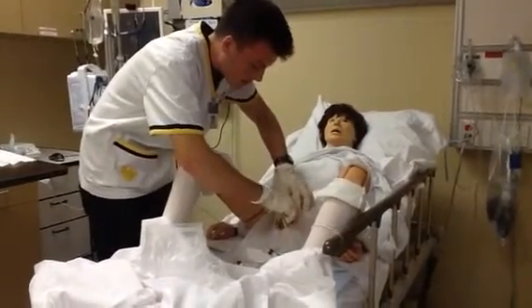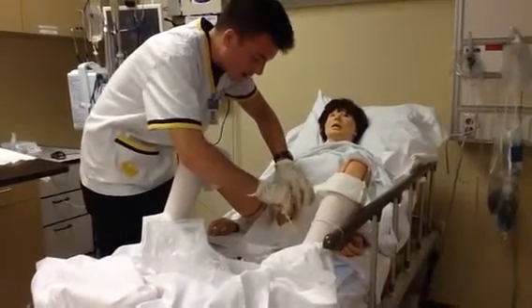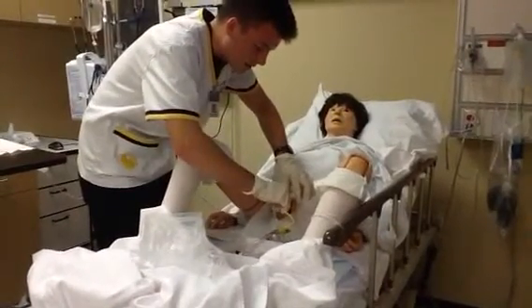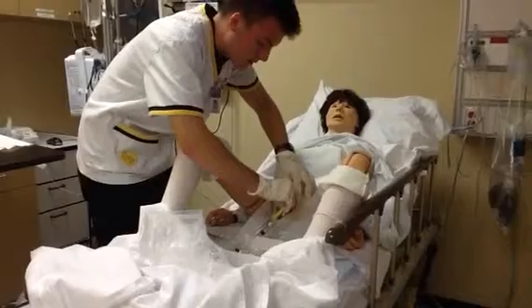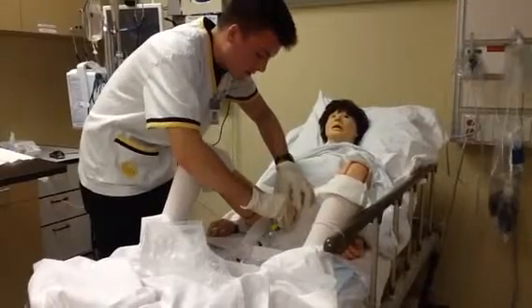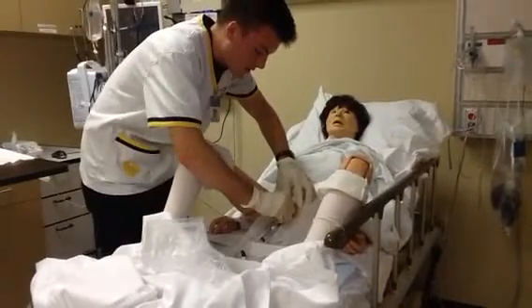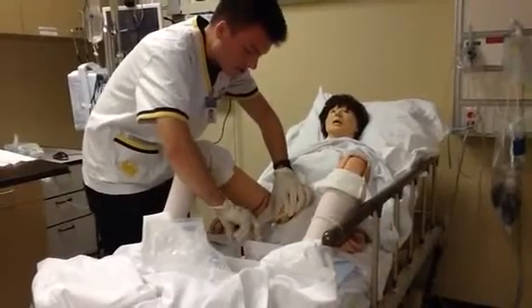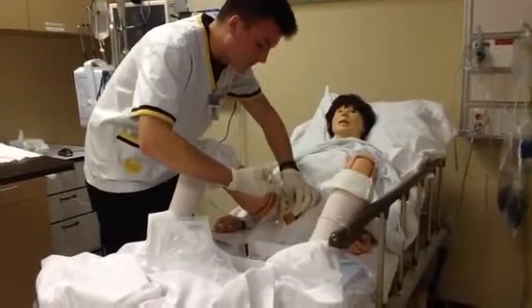And I will begin catheter insertion, making sure that the catheter does not touch any skin on the way in to keep it sterile. Making sure that my right hand does not touch any skin to keep it sterile. Continue to insert it. Okay, I see urine, so I'm going to go about another inch. And I have gone about another inch, so I'm going to take my left hand here, and pinch off the catheter, not pinch it off, but I'm going to grab it. Take my still sterile right hand, and I'm going to blow up the balloon.